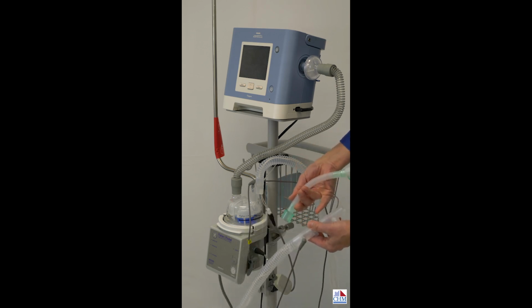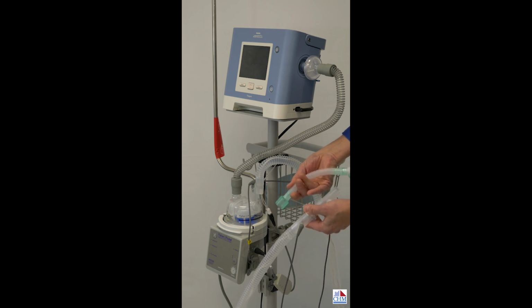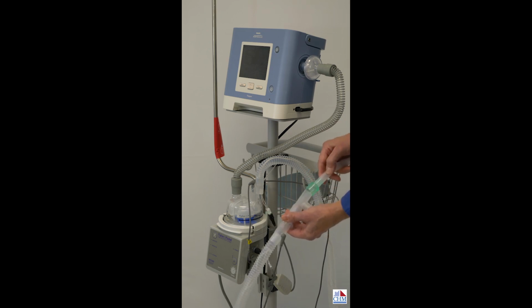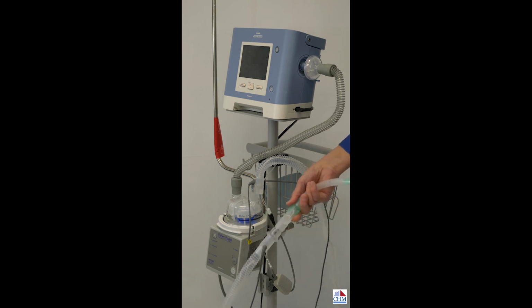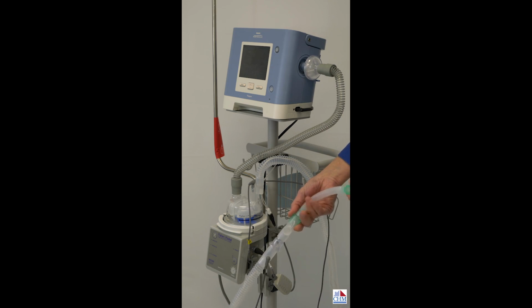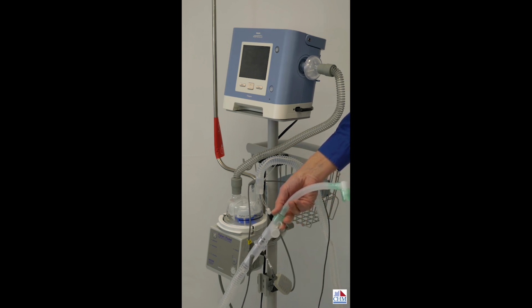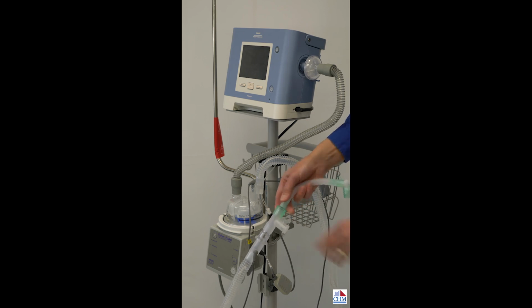And then there's a trach swivel adapter with a flex tube on it. This allows attachment directly to a tracheostomy tube with some flexibility and the ability to swivel a couple of different ways so you don't put torque on the trach tube. So that completes our circuit.